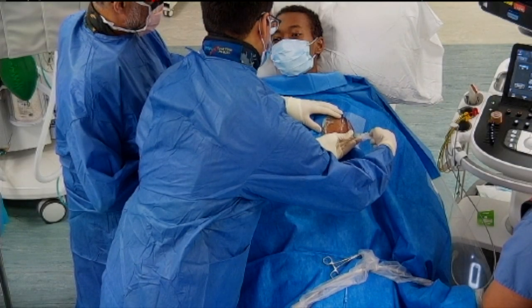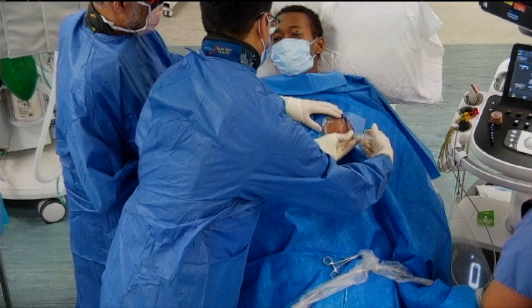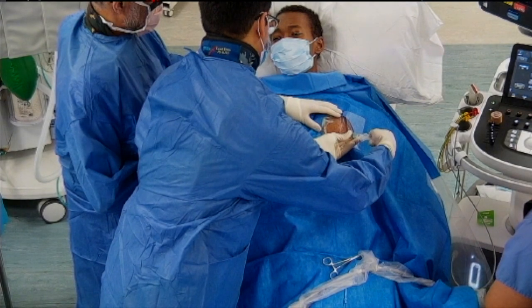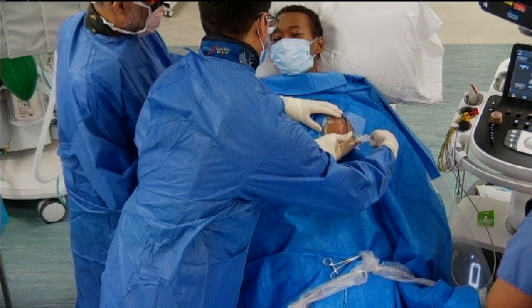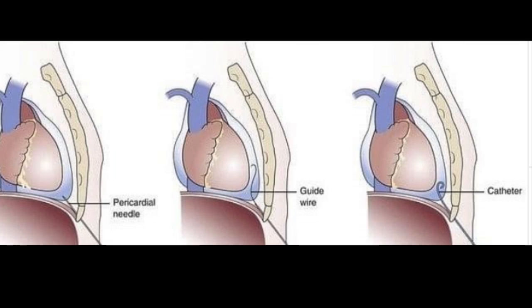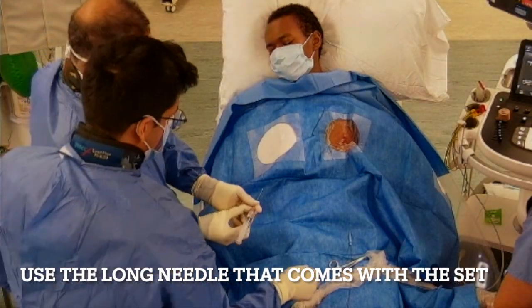As we infiltrate down, we slowly go deeper — inject, then go deeper and inject again. Each time we push in we also pull back to check. We're trying to get the needle into the pericardial space where there should be a generous amount of fluid, and not into the ventricle, which would yield pulsatile red blood — which would not be a good thing.